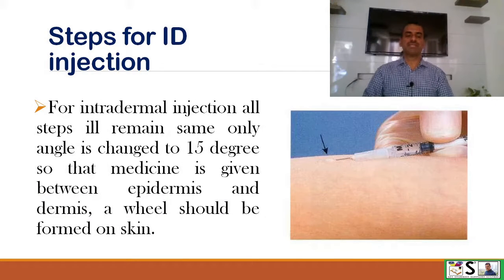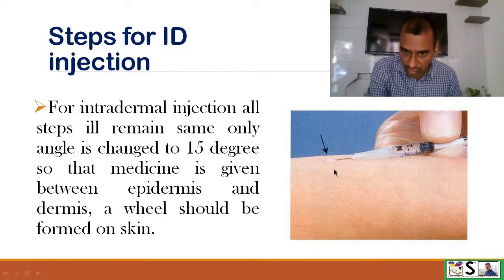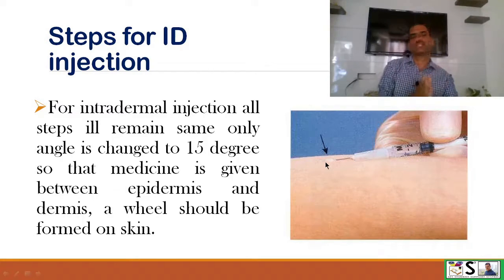And for intradermal injection, all steps will remain the same. Only the angle by which we insert the needle is 15 degrees or less than 15 degrees, so that the medication is given between the dermis and epidermis. While giving this medication, a small wheal is formed like this. Then the injection is okay.